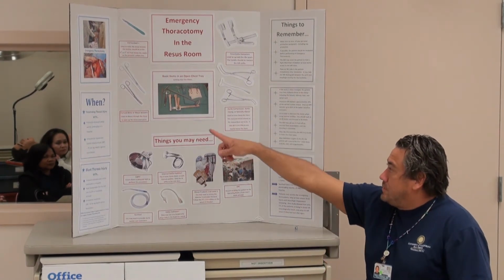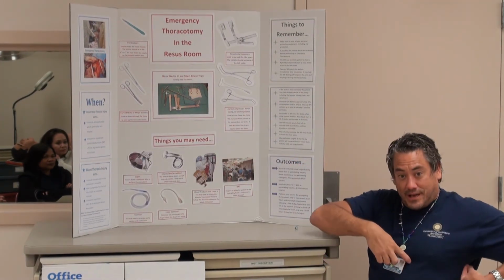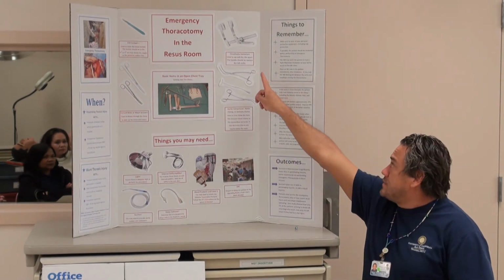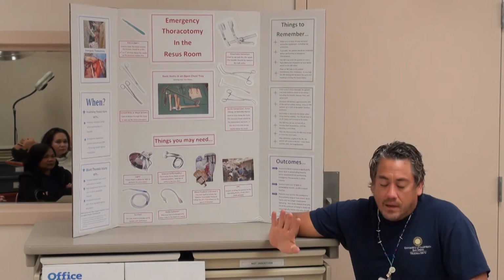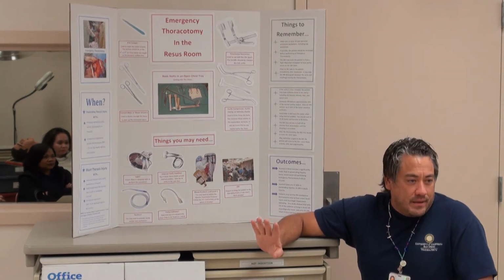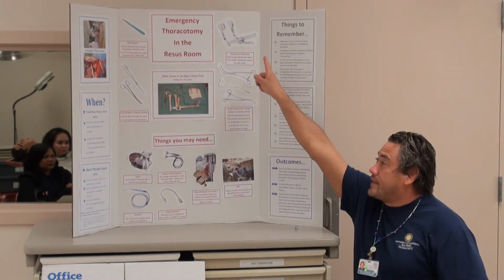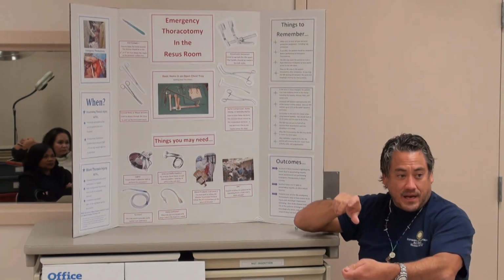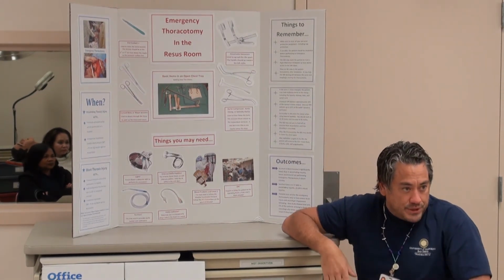And then once you separate the tissue and cut an opening there, you get the rib spreader in. The way it's supposed to go, they come apart, they're in two pieces. So this separate piece is not on there. One time we had an open chest code.